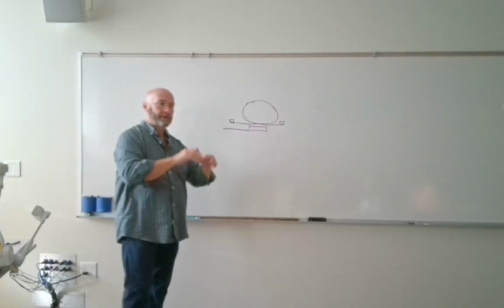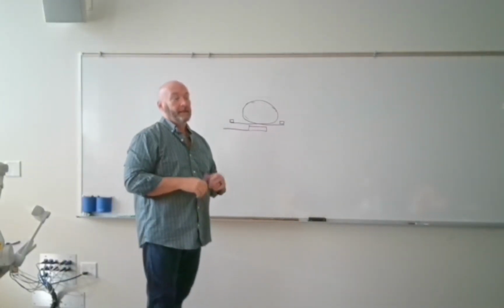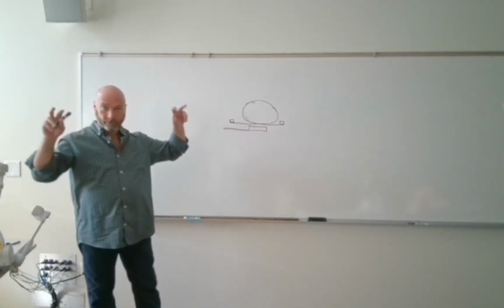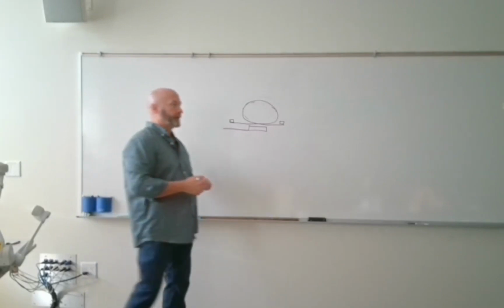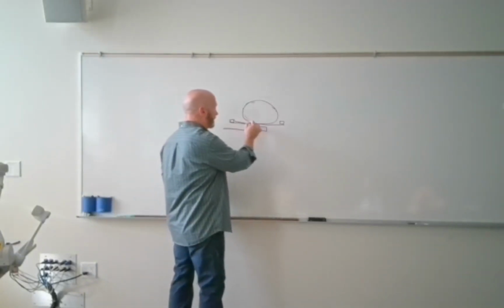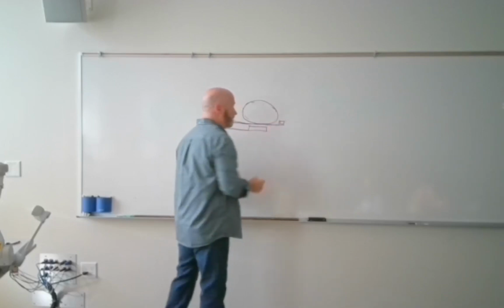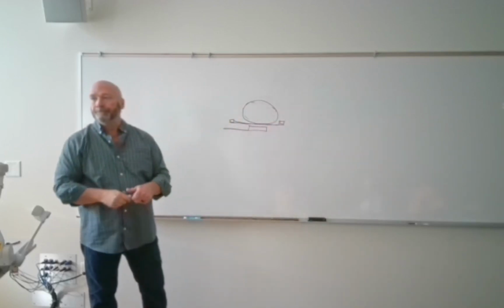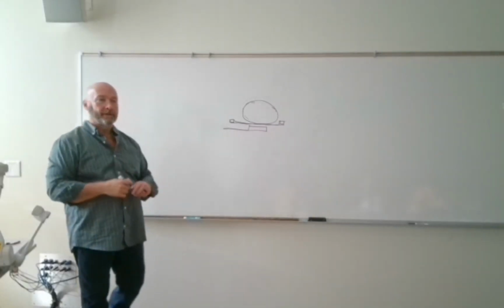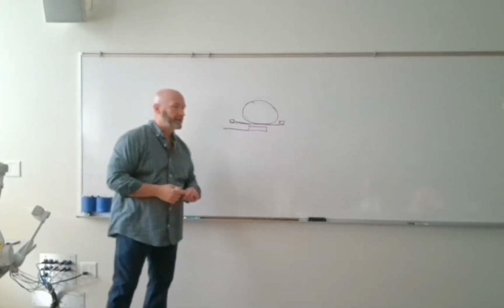Okay, so your tabletops can either be flat, that's great from an imaging standpoint, or they can be what they refer to as a curved tabletop, and the curved tabletop could come off of the top of this and then dip down like that, and then come back up. Either way, that's what we refer to as a curved tabletop. The problem with a curved tabletop is this.